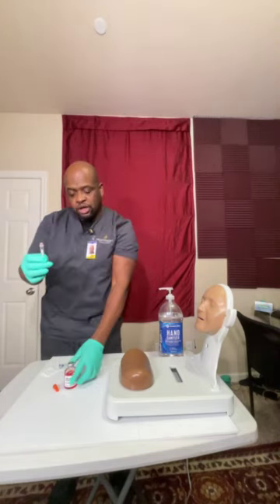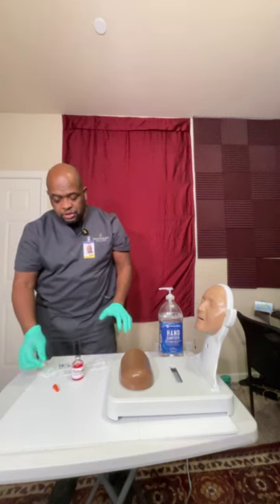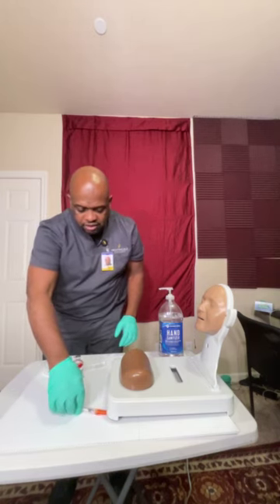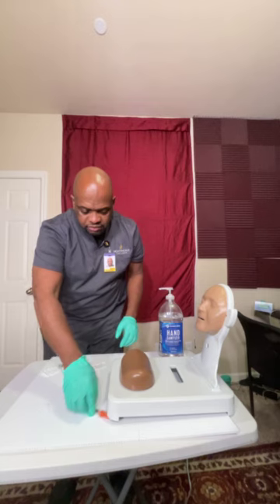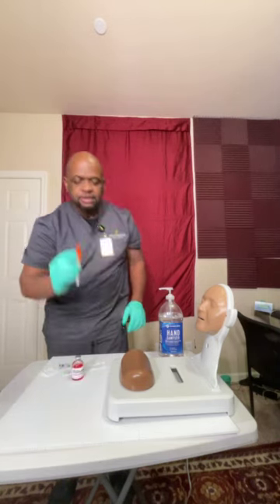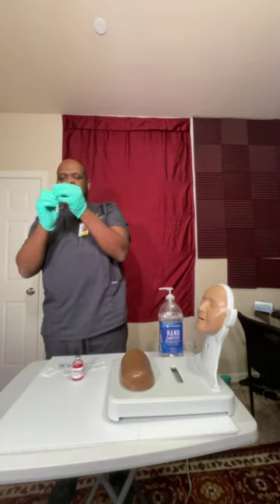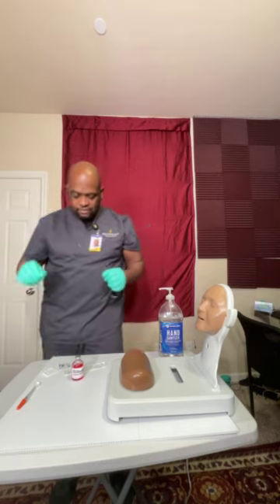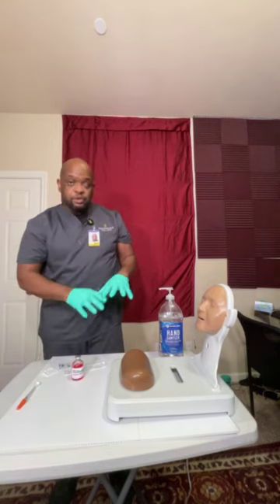But I'm going to recap this because I need to prep the site where I'm going to be giving the injection. So I'm going to go ahead and use the one hand scoop. Okay, one hand scoop. Let's put that there on the cap. There we go. Okay, good. And make sure that's on tight. One hand scoop is there. All right, now I need to go ahead and find the site.